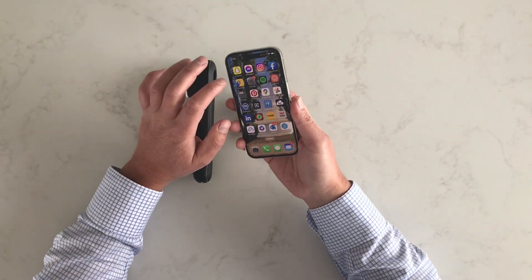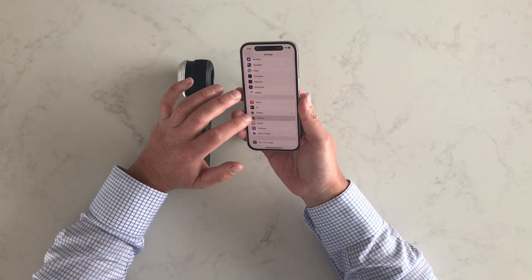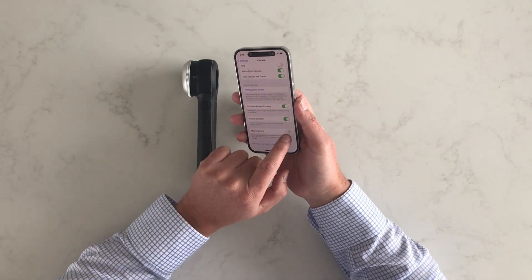So to overcome that, simply go to the settings, go to the camera option, go right to the bottom, and click the macro control button.